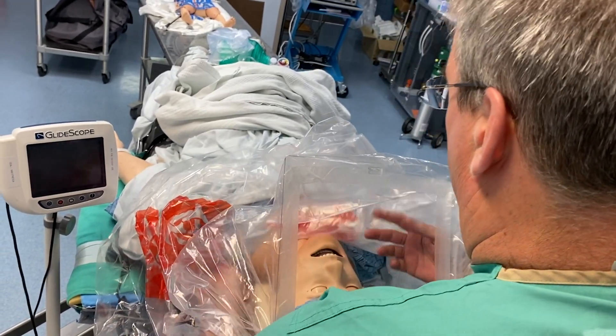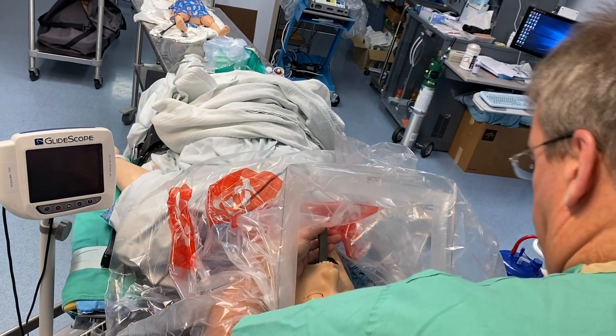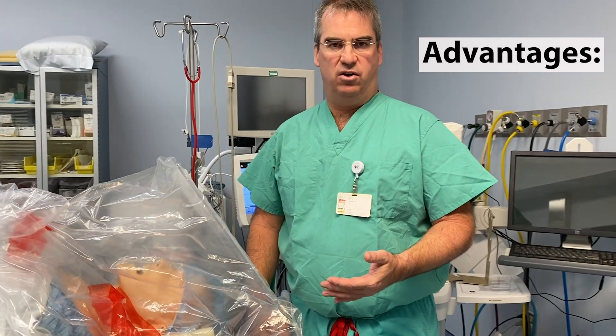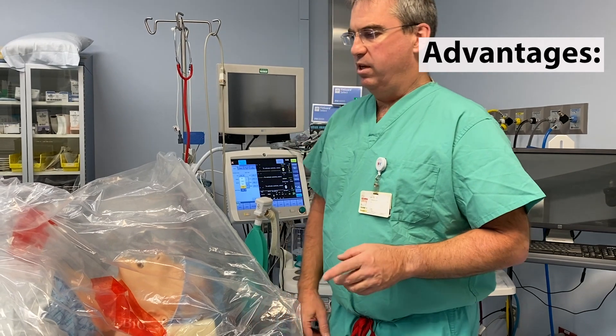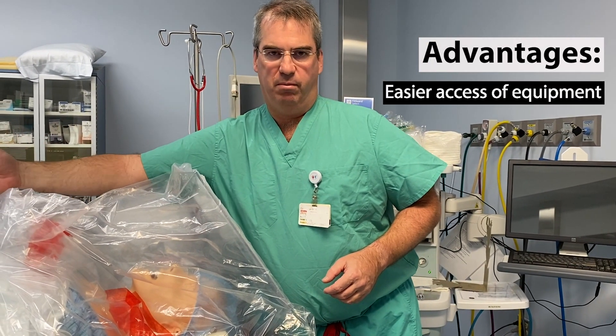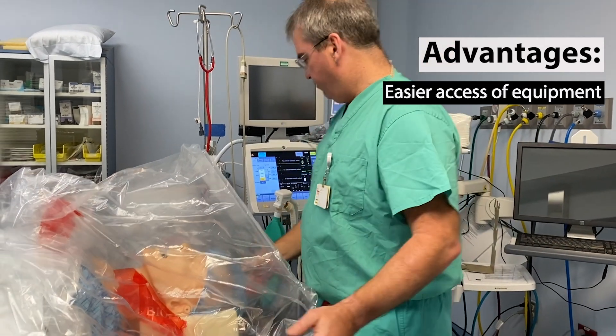One could also use a video laryngoscope to intubate the patient. There are several advantages of this over the standard intubating box, which we've also used. One is that the intubating box has to have all of your equipment coming in below from the box. With this, it can all come in from the side.